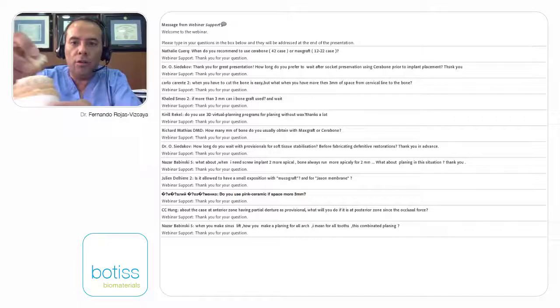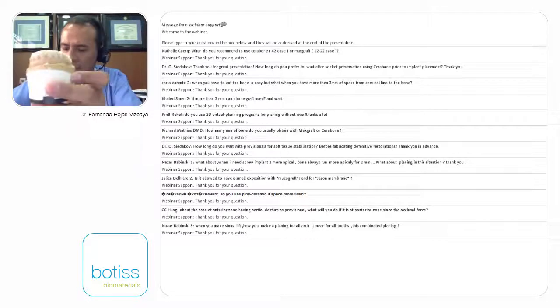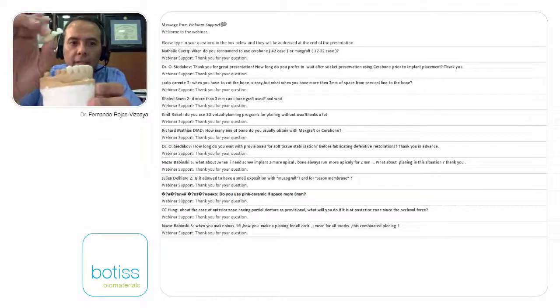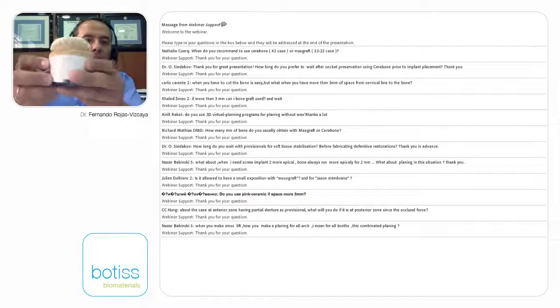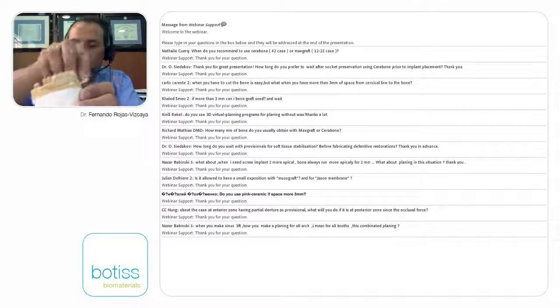this is another block for this area. And I think this is for the other side. It's like some small veneers. And we can check in the mouth of the patient. And this was made virtually. And you can do all modification virtually. Okay.